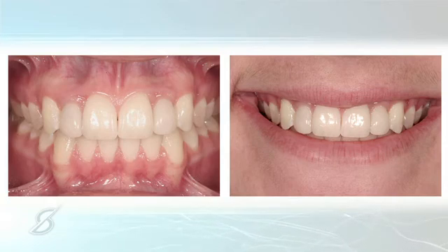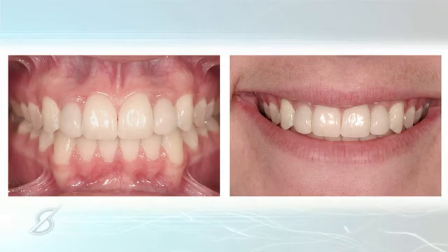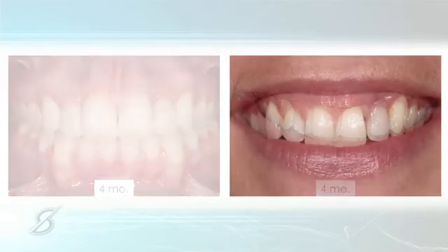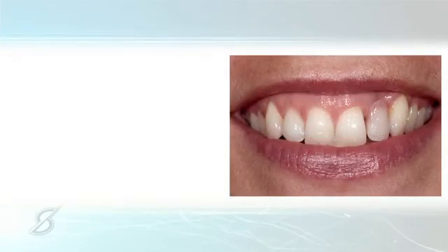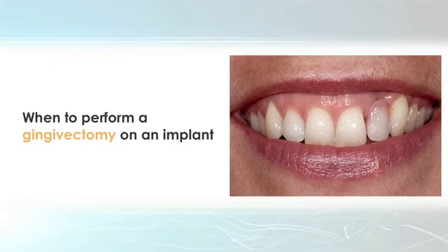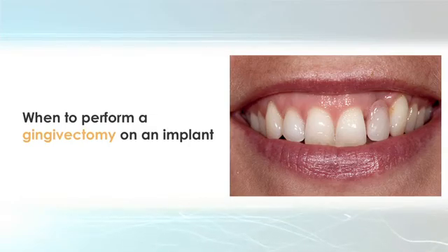Now, are there times that you actually might need to do a gingivectomy on an implant? And the answer is yes. Because there are some grafts that are simply so thick that your temporary contour just doesn't make the tissue behave the way you want, and you need to actually do some surgery. So let me show you this last patient that will illustrate that.